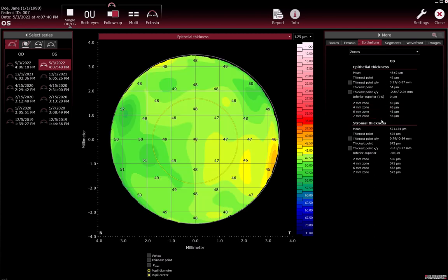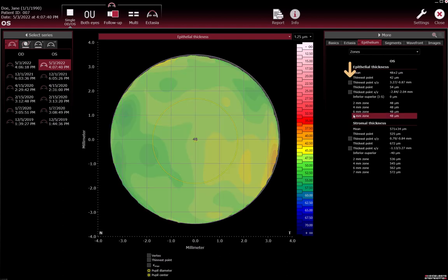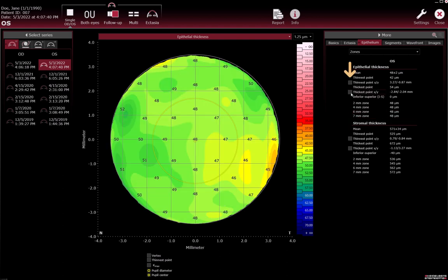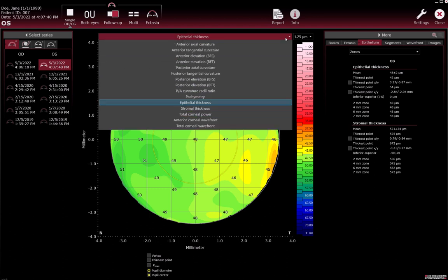Some of the epithelial thickness parameters can be shown as overlays on the colour maps. To do so, select the checkbox next to the name of the parameter. To display the stromal thickness map, select it in the drop-down list.